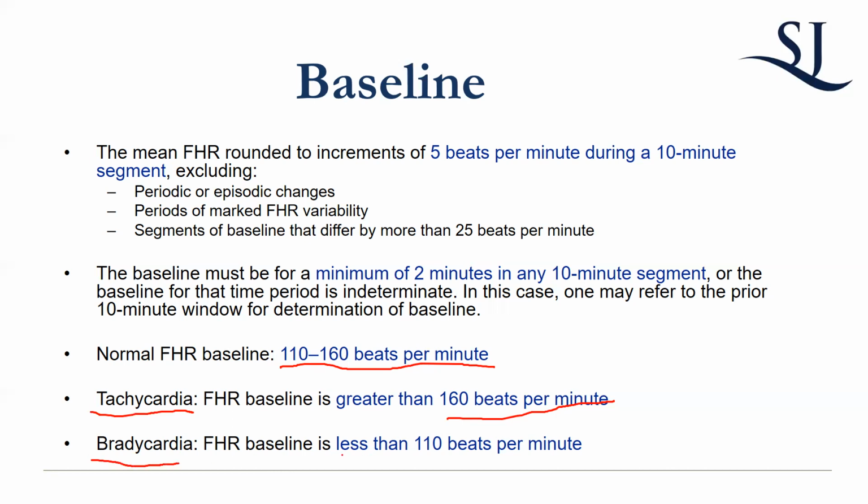Bradycardia is the opposite. That's when you have a fetal heart rate that's less than 110 beats per minute. And there's not really situations where you have benign fetal bradycardia. That's usually due to distress. Sometimes, every so often, you have a patient whose fetus is like 100 beats per minute, and you're kind of like, oh my God, what do we do? And really it's normal. That's not very common, but generally, if you want a take-home message, bradycardia in a baby is usually not a good thing. And it's usually not a normal thing, where tachycardia can be.